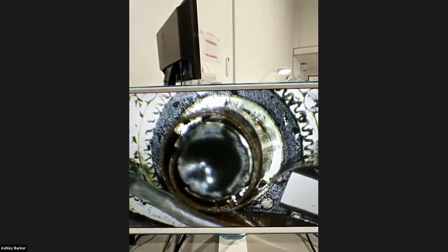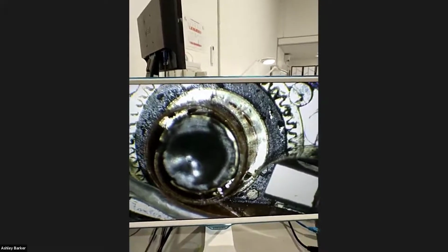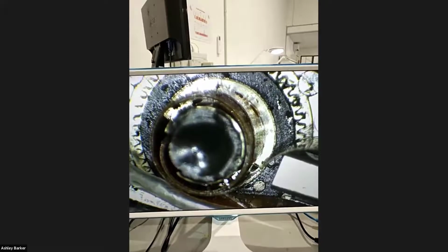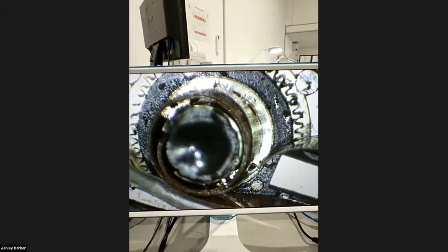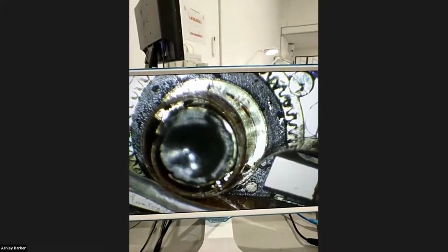And the biggest things that damage the transesophageal probes are things like metal sinks, because you give it a good clean and a wash in a metal sink, you only need to let go of that tip and it's smacked into the side, and the impulses are huge and it just damages the parts inside.